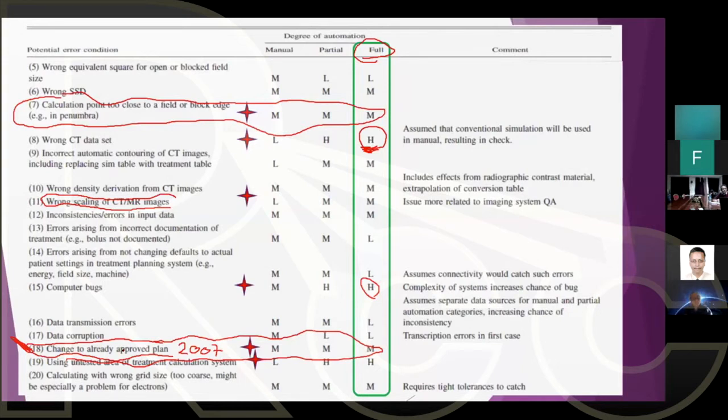They called physics again. What we had to do was complete the old plan early and make sure that the fractions received from that old plan are added up to the new plan. And we had to make sure that the fractionation itself is correct, so the record and verification can continue counting the correct fraction numbers and correct those.